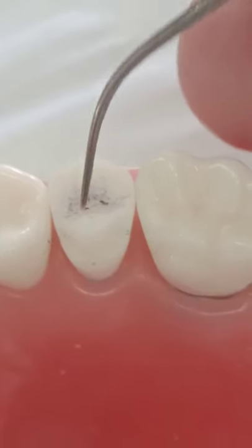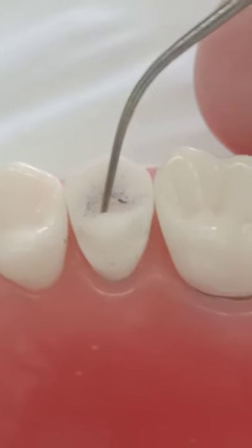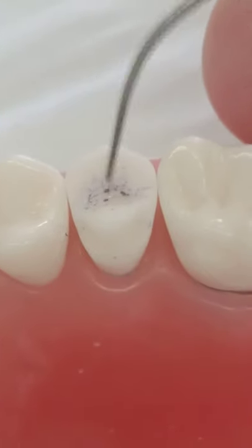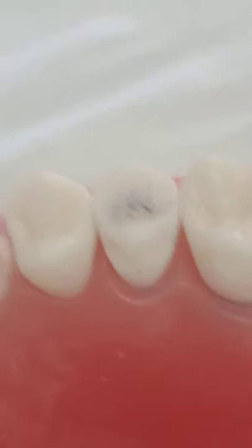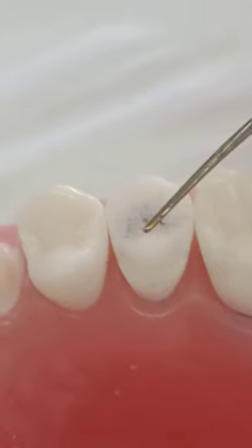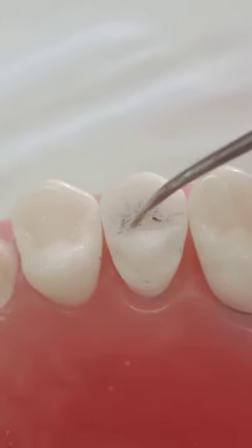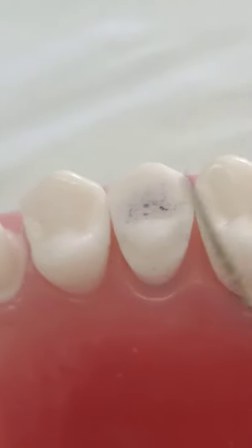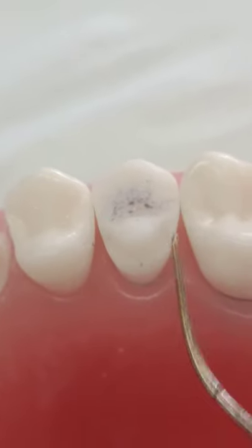Everything is excellent except the occlusal reduction — I think you need to go more. Occlusal thickness depends on the material: if it's a gold alloy or base metal alloy, one millimeter is enough, but if it's ceramic you need more. Overall, this is almost a very good restoration. My comments were only about the angles — if these were rounded it would be an excellent preparation — and lingually you are over-prepared; you can stop one millimeter above the finish line.